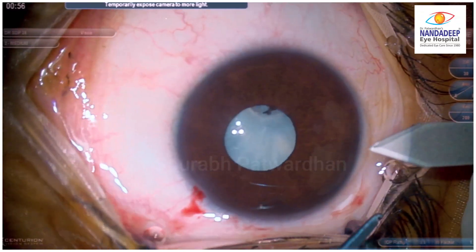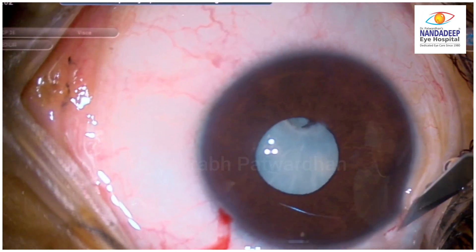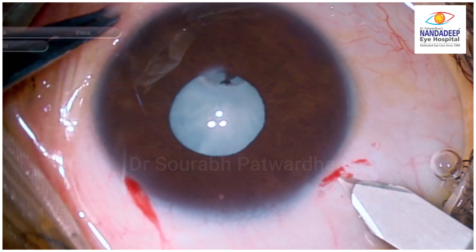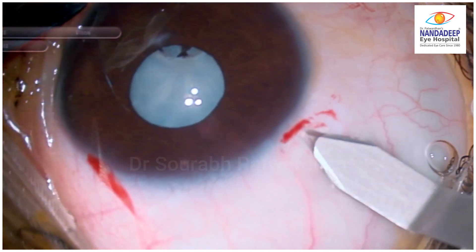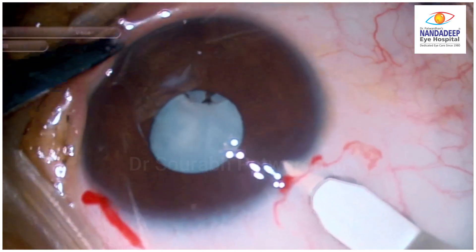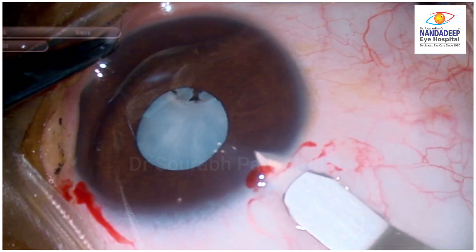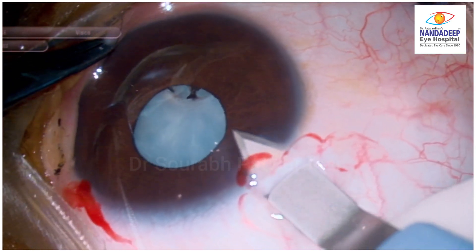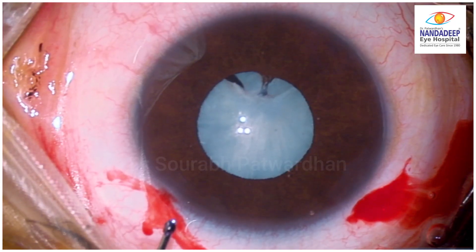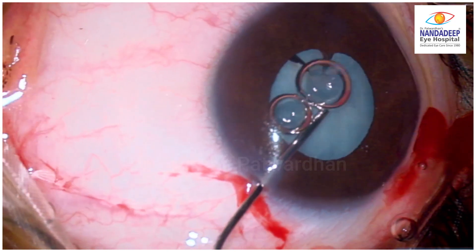I have taken this patient under peribulbar block. In these particular cases where we don't want any inadvertent movement of the eye which may jeopardize the final result, I usually take these cases under peribulbar block. As you notice, I am making a corneoscleral tunnel incision because here you can see there is an area with a ruptured capsule.